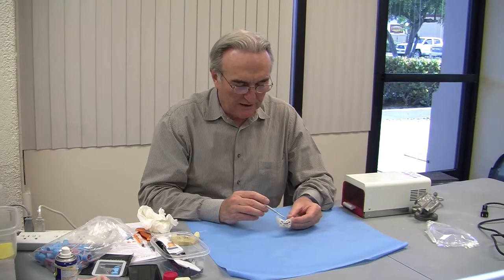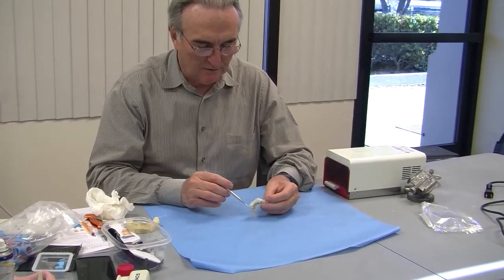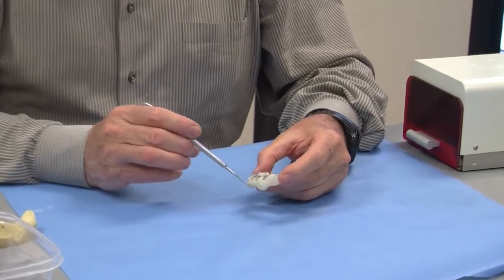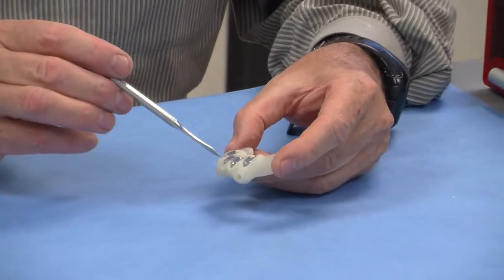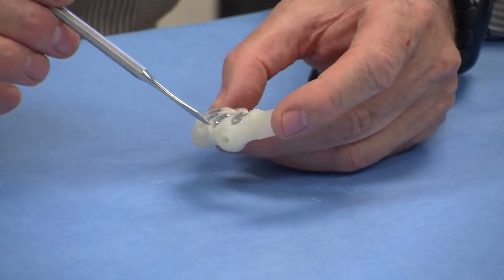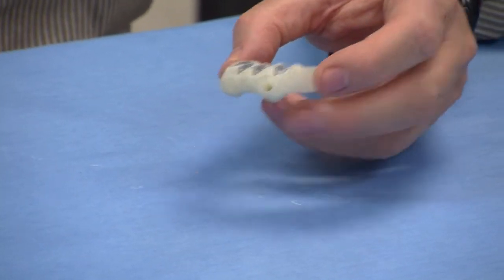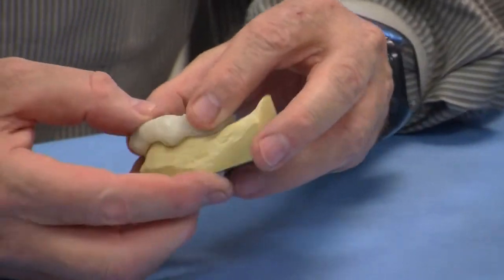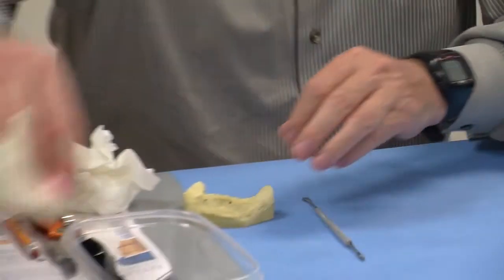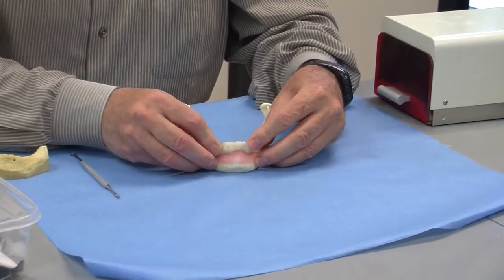The surgical guide or frame is finished with traditional technique from a lab, and so we have the different guide holders here in aluminum, and here we have the two cavities, and we can see that it fits the model very well, and because of that, it will also fit the patient very well.